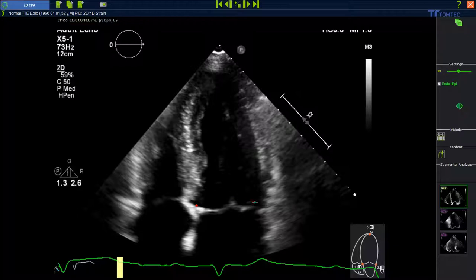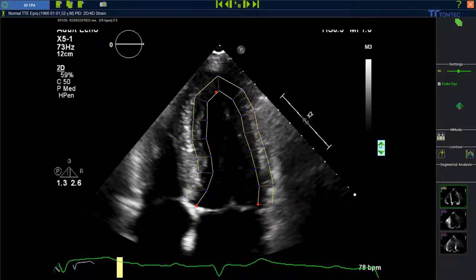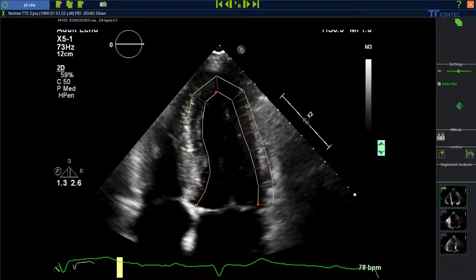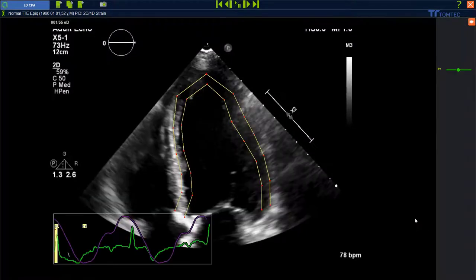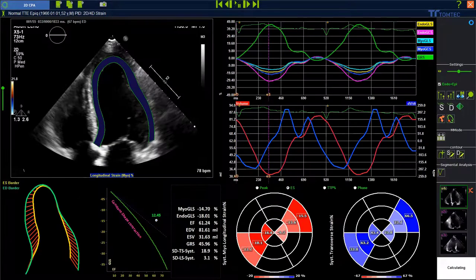Set the reference points as described, starting with basal and then the apex. Make adjustments by grabbing the red dots and proceed to start the analysis. Once the first complete contour becomes visible, you can adjust the proposed contour by dragging and dropping the red contour points.